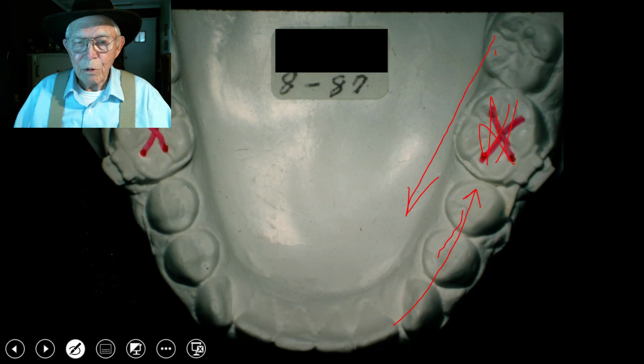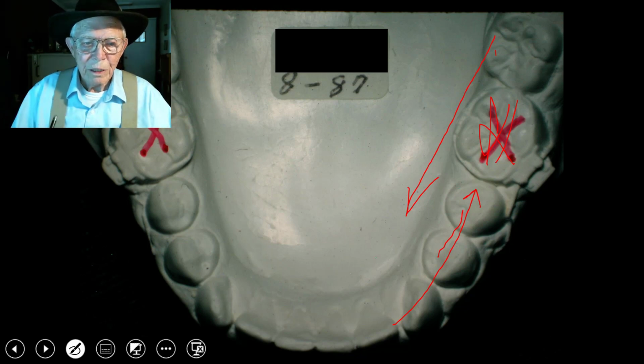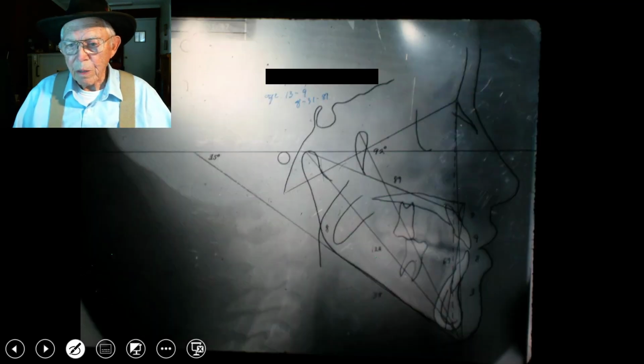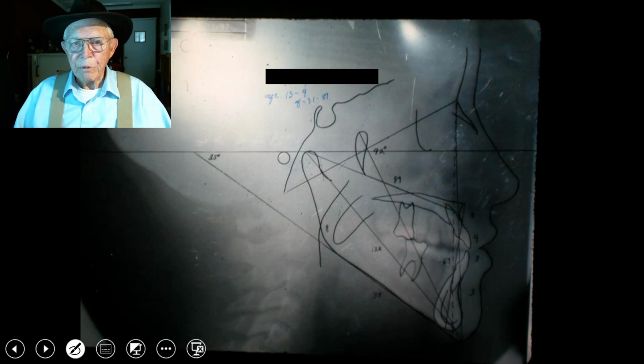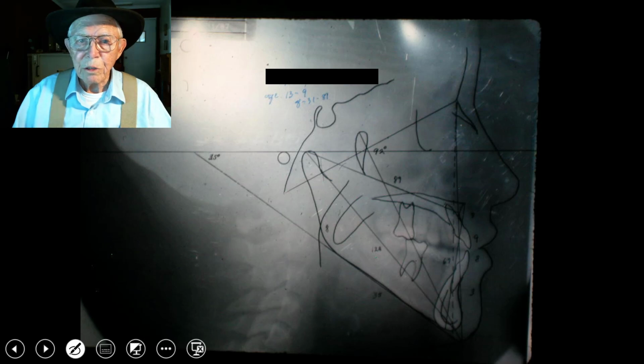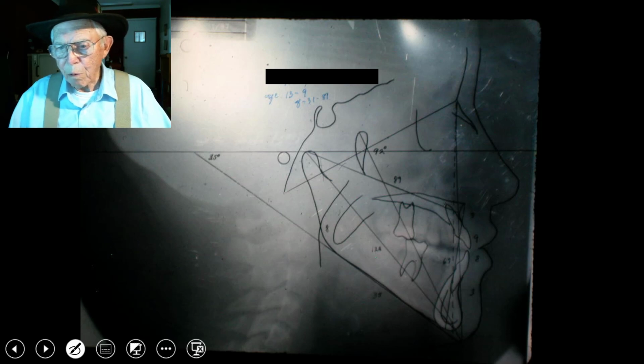Now it's hard to explain this like I'd like to for each person doing this, but it will correct both of them if you just continue pulling that on back. Now we'll go ahead. Here is the cephalometric picture we took on this young lady in 1987. I think 8/31 of '87, and she's age 13 and 9 at this point.